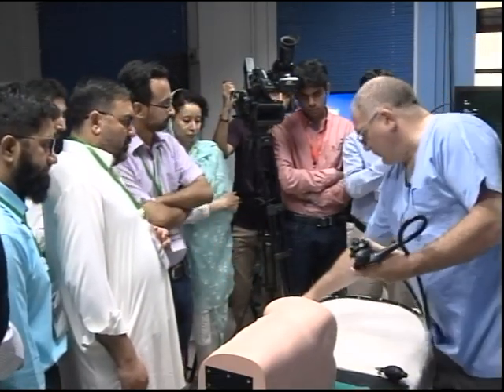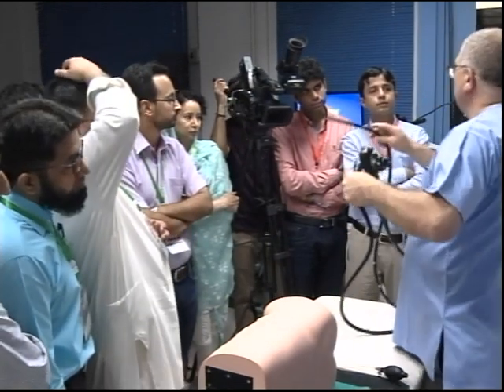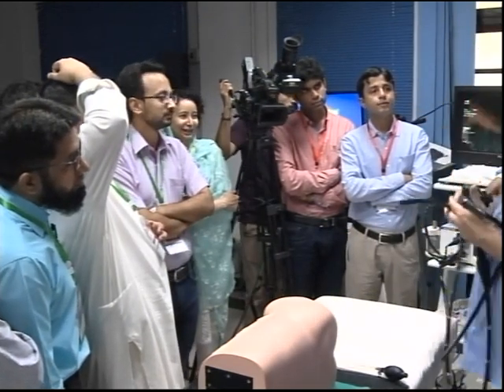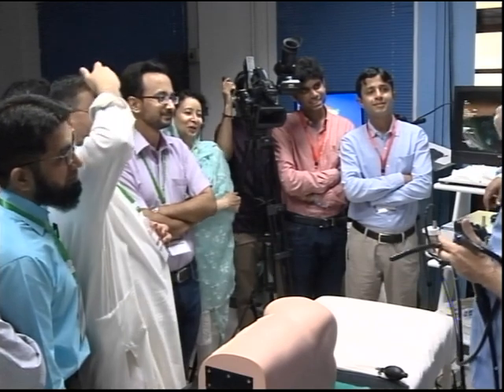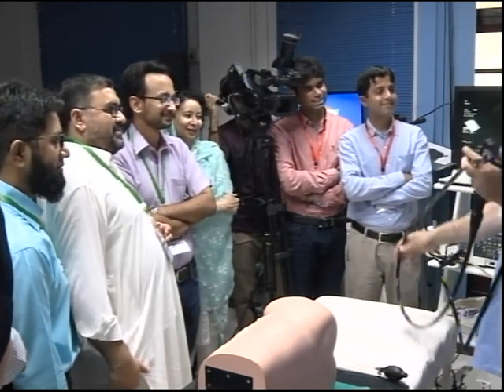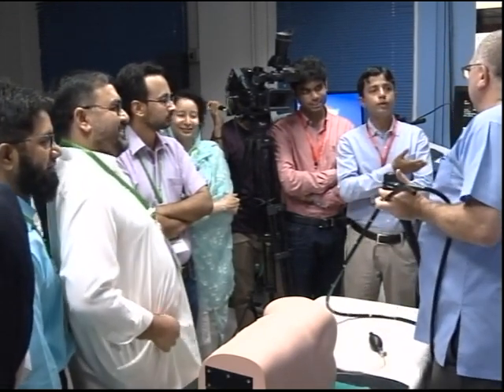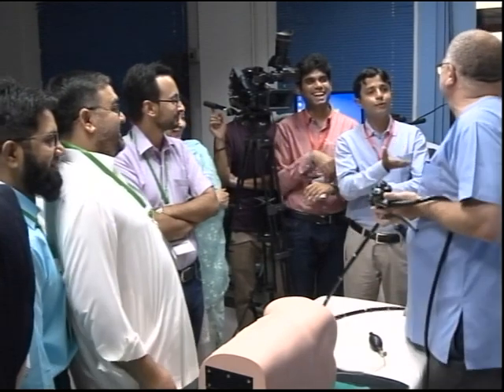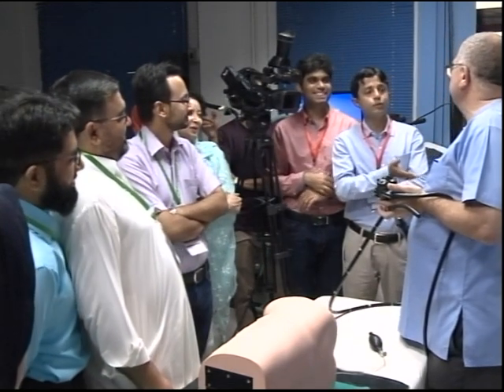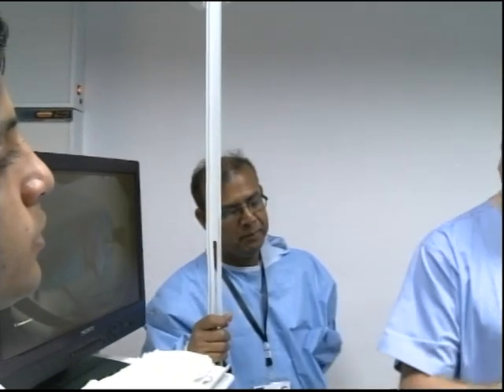How do we completely know that loop has been reduced? Paul. Yes, Paul. So what do you want to know? How do we know during colonoscopy that the loop has been completely reduced? If you advance the scope and it reforms, then you haven't done it.